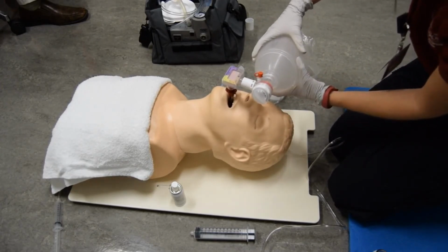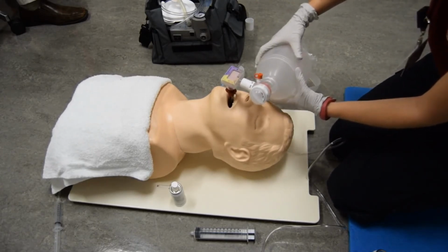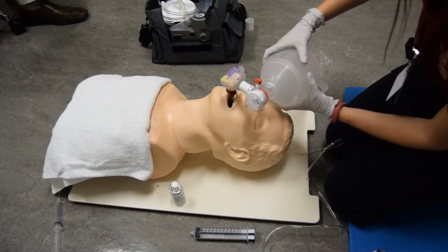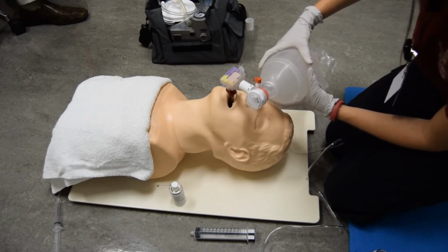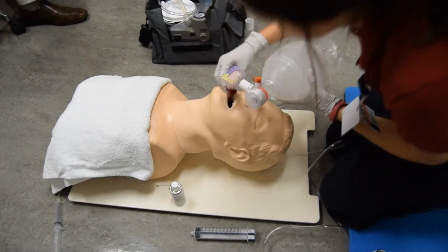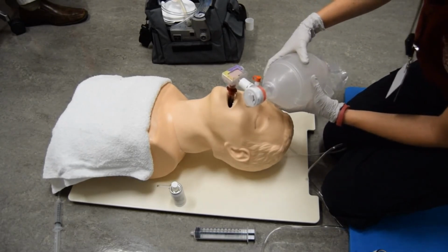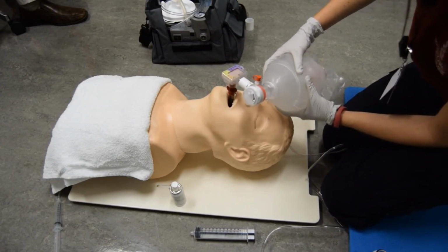The examiner must now ask the candidate, how would you know if you were delivering appropriate volumes with each ventilation? Looking for bilateral equal chest rise and fall. Secures device or confirms the device remains properly secured. The device is properly secured. Ventilates patient at proper rate and volume while observing capnography, capnometry, and pulse oximetry.